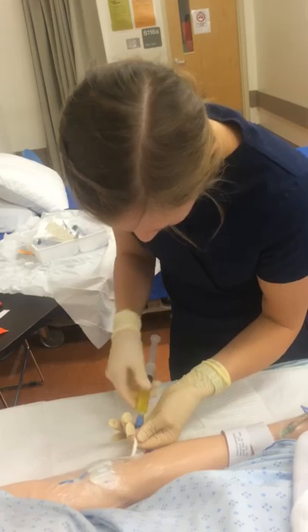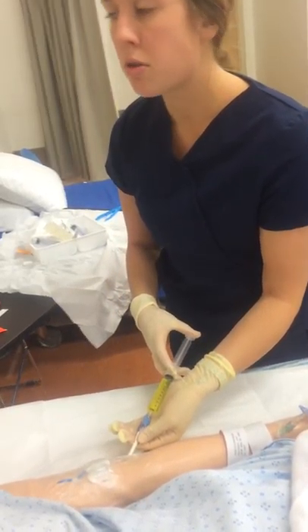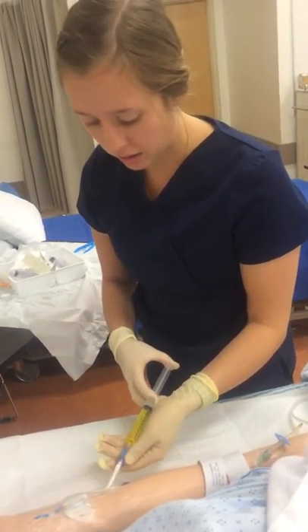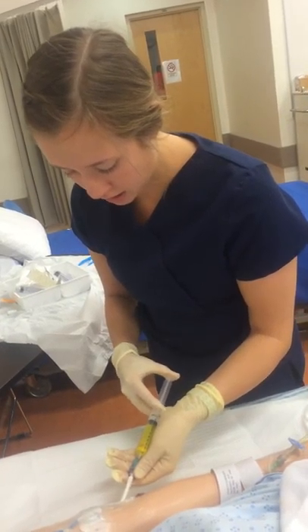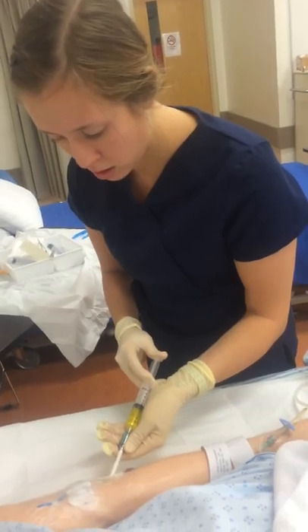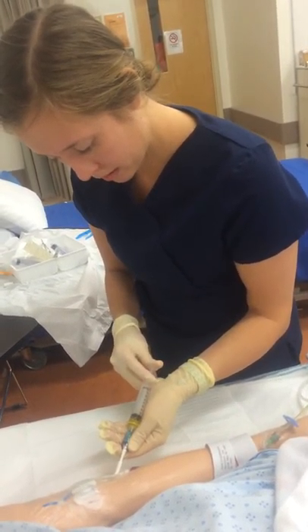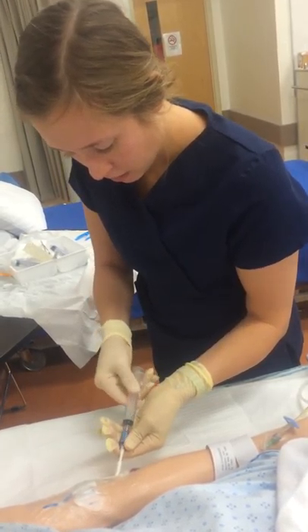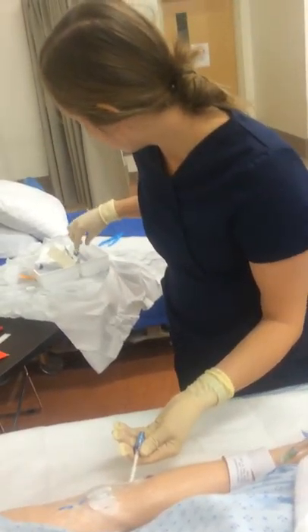That's a good sound. Alright, so then I'm going to do my med. So I know that this is my cefazolin. I'm going to administer over 3 to 5 minutes. So normally I would look at my watch, 3 minutes, I'd give it, but for the sake of time, I'm just going to administer quickly again using that turbulent flushing method, looking for the ease of the drug to go into the port.